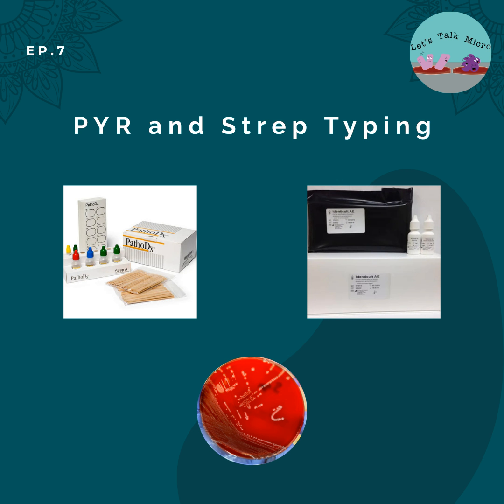The lack of agglutination is a negative result. So if you see clumping, it's a positive result. If you don't see clumping, it's a negative result. And since the latex is blue, it's pretty easy to see.